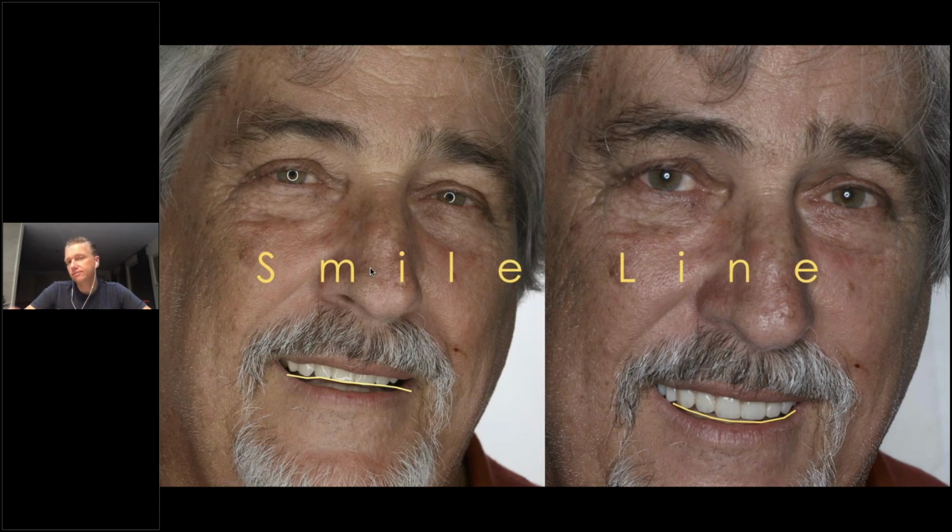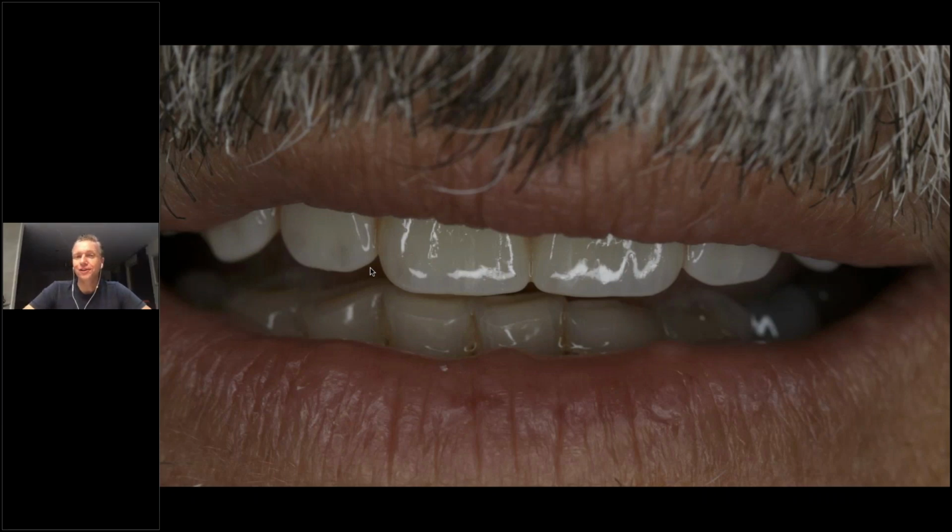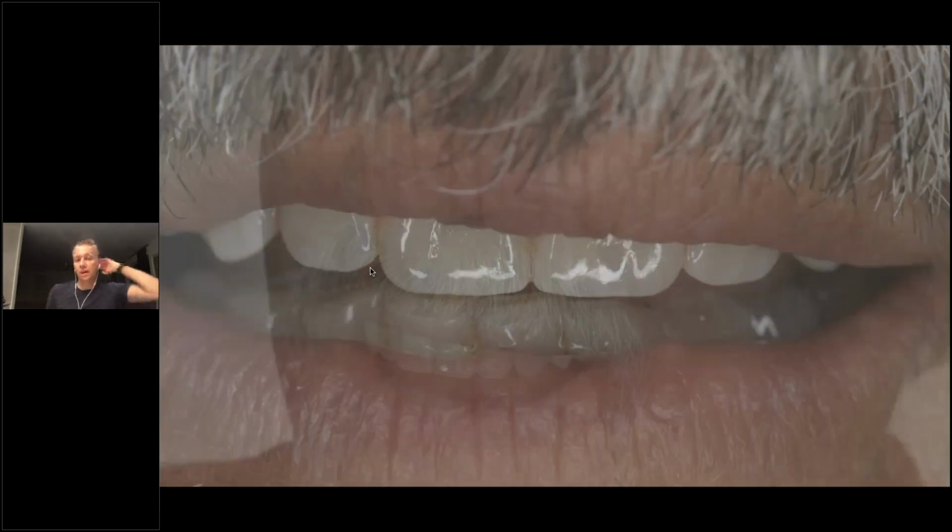If you look at it just aesthetically, digital dentures can look really good if they're made well and if you know how to work with the material. A digital denture can look really aesthetic. He said, oh my god, this looks much better than my immediate denture. He's wearing this all the time now. I think that's good feedback to get from the patient, that he likes his new teeth and likes to smile with them. They fit perfectly. That was his feedback. So he loves them, he is very happy.